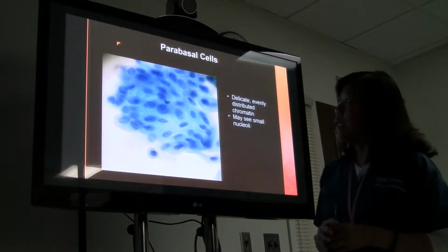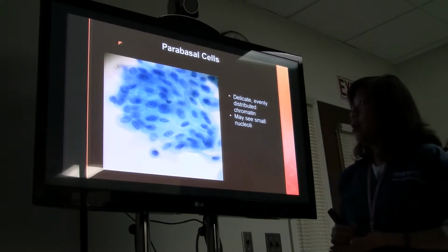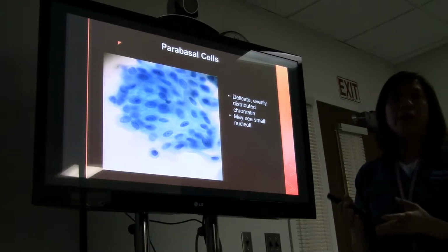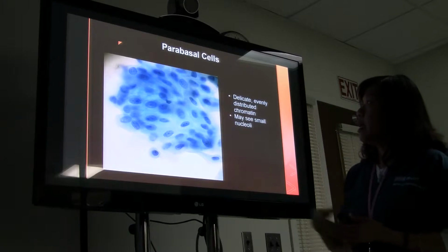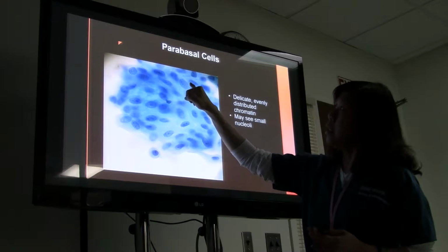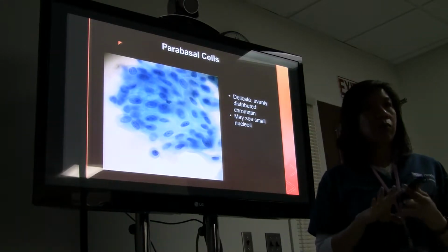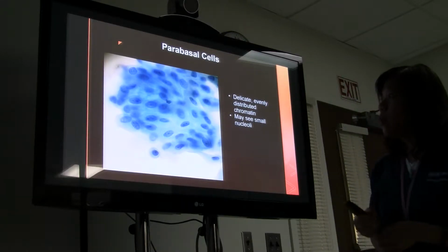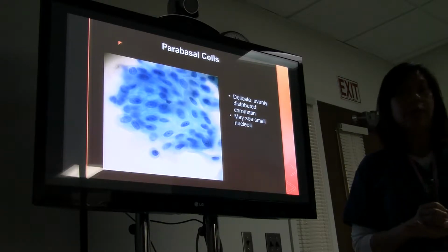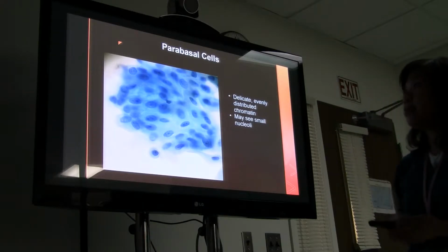Each one of the nuclei still looks very uniform and similar to each other, okay? They're not much bigger. Some may be slightly smaller, but usually no more than 2 times. Like this one here, it's very similar to this one, very similar to this one. It may be a little bit smaller, but the chromatin is the same. Very uniform, even distribution. Okay, so those are the characteristics of benign normal cells. Regardless of what kind of cells they are, they still have this kind of general characteristic.